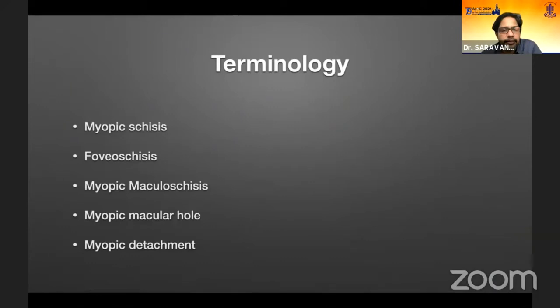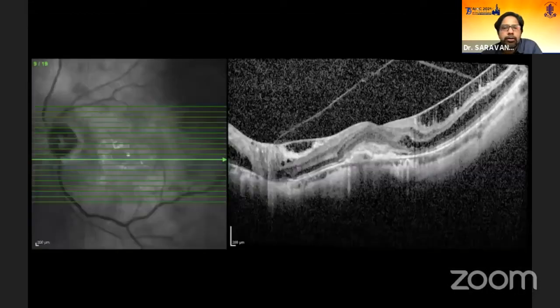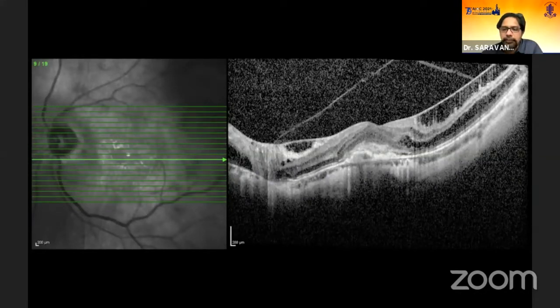Various names have been given to this entity, but right now MTM, or myopic traction maculopathy, is one of the more popularly used terminologies. Here you can see a myopic CNVM along with the myopic macular schisis.